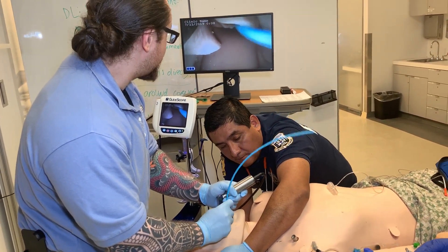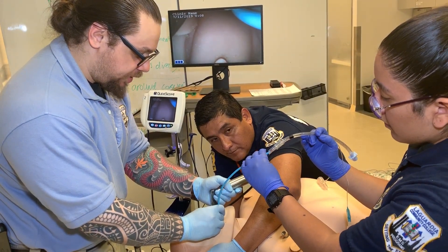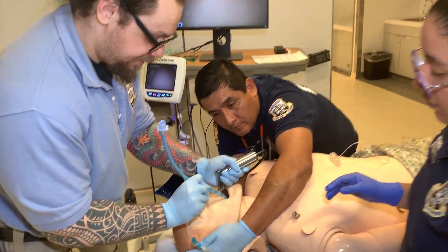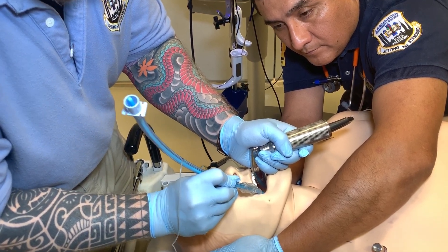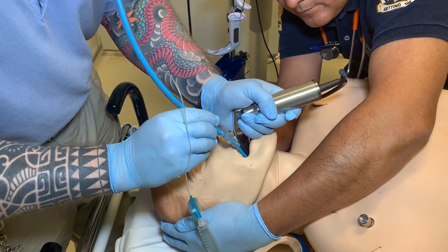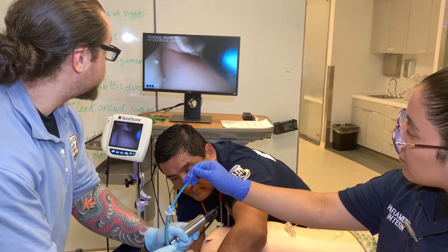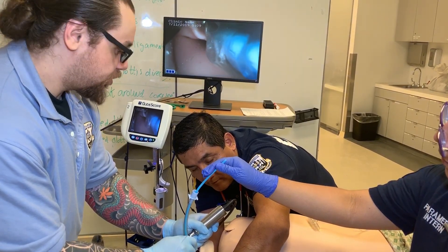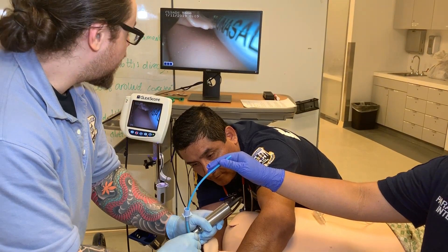Once I have hold-up I know I'm in the right place. My partner loads the endotracheal tube over the bougie. It's very important that the operator maintains the hand on the laryngoscope blade. One important point: if you notice the bevel of the endotracheal tube is pointing to the side, it can get caught on the pre-laryngeal inlet. So when loading the tube, orient the tip facing down. Slowly advance — if it gets caught, pull back, rotate to the left, and go forward. I confirmed placement on the video laryngoscope screen.